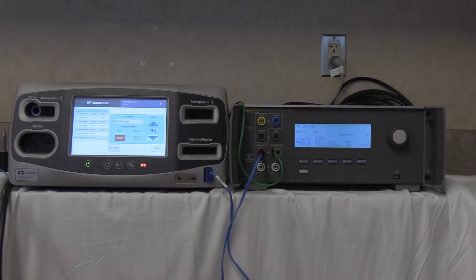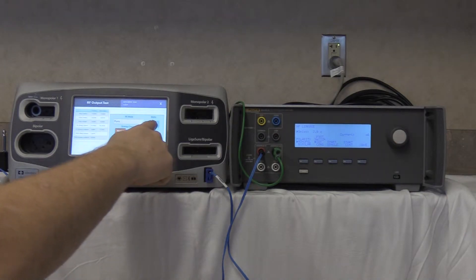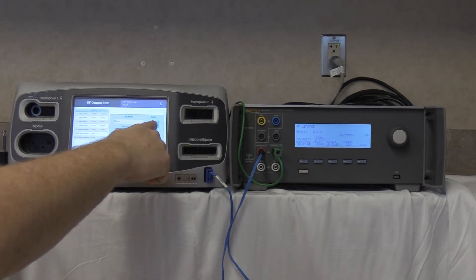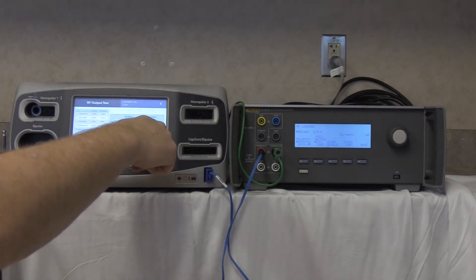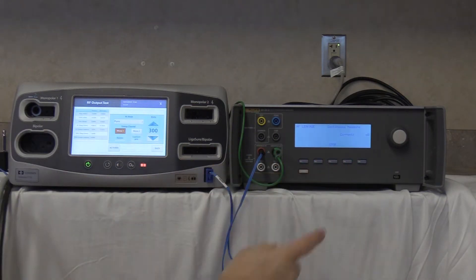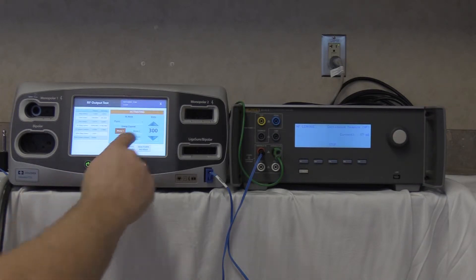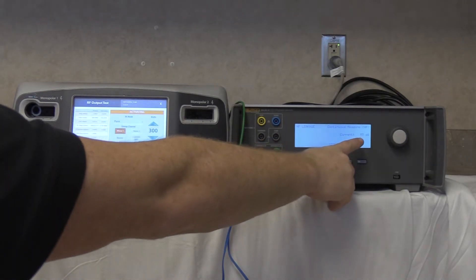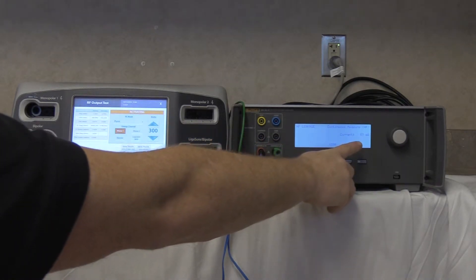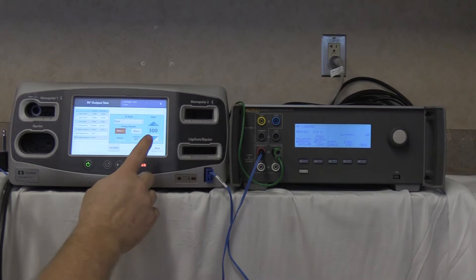Still in high frequency leakage mode, go to pure cut at 300 watts. Activate the QAES-3 using F4 and activate the FT10. Our reading is 57 milliamps. The maximum allowable reading is 100 milliamps. Deactivate, no-hold, stop the QAES-3.